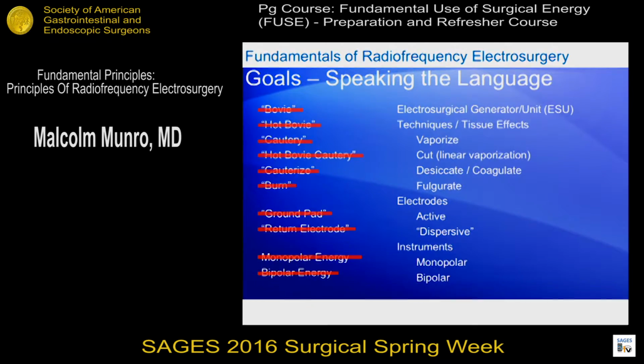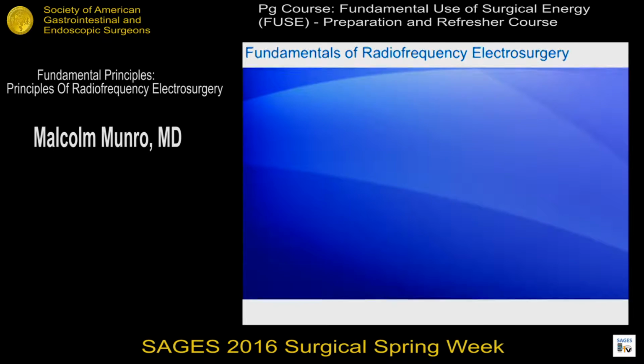And there's no such thing as monopolar energy or bipolar energy. Those are just incorrect terms. You have instruments that can be monopolar and instruments that can be bipolar, and we'll give you an understanding, hopefully, of what that means. So what is this RF electrosurgery?